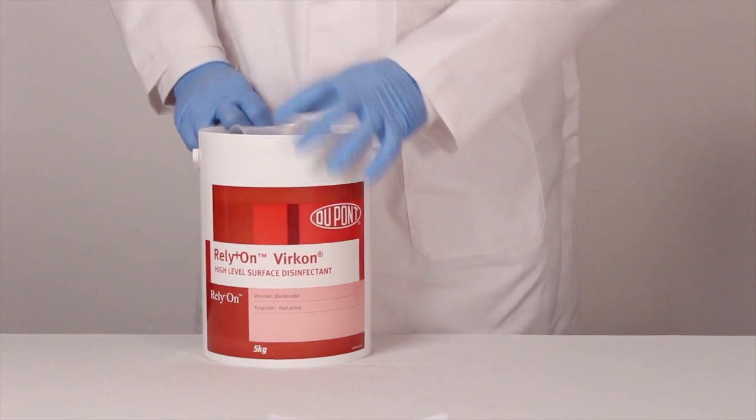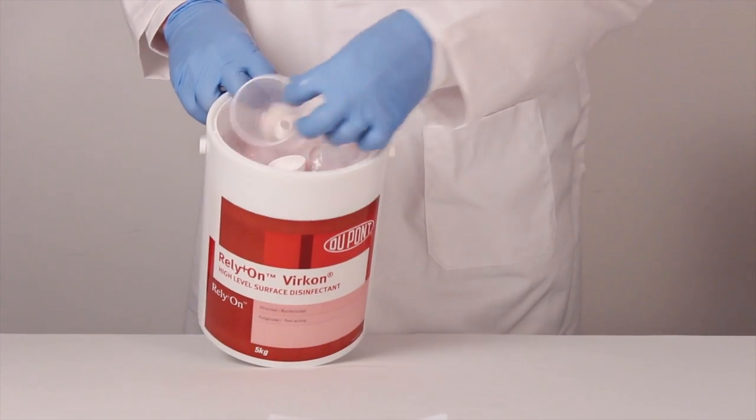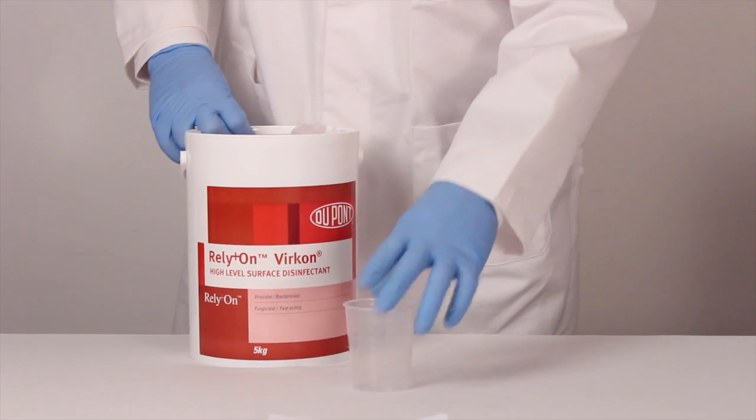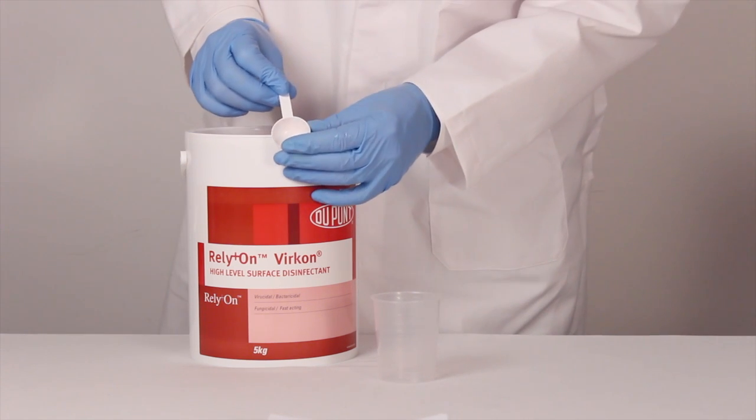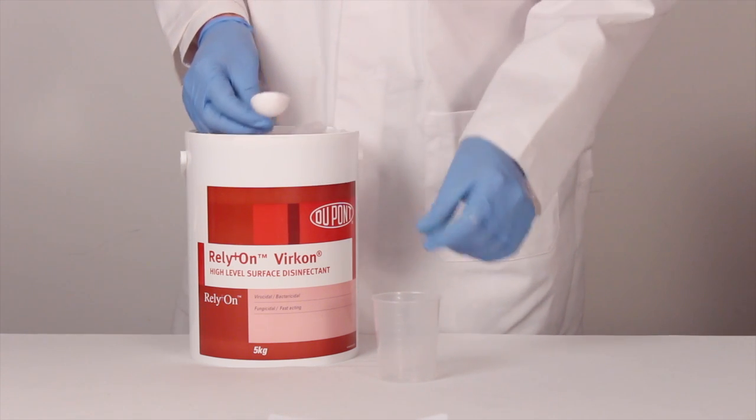Inside of the drum itself you can see it includes a plastic measuring cup which is used for larger quantities. Also inside is a 10 ml scoop which we will be using today to make up our 1 liter.